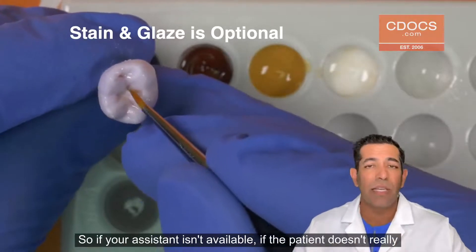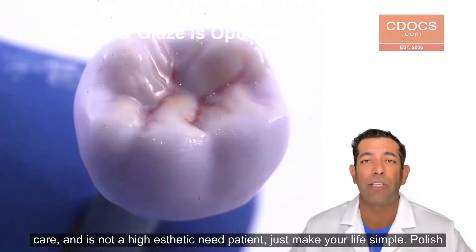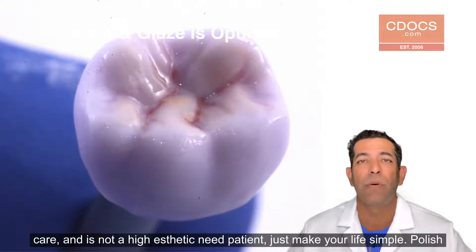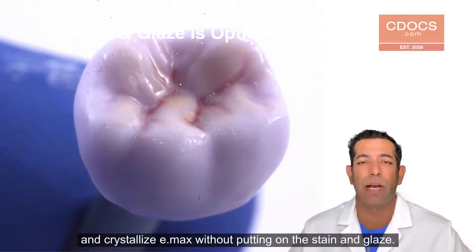So if your assistant isn't available, if the patient doesn't really care, not a high aesthetic need patient, just make your life simple. Polish and crystallize eMax without putting on the staining glaze.